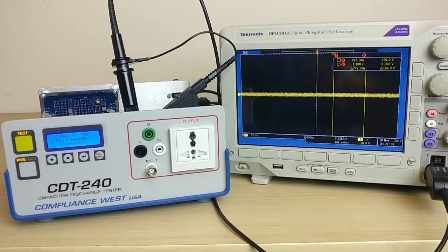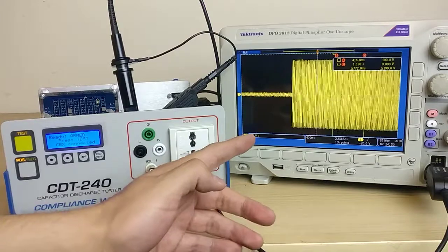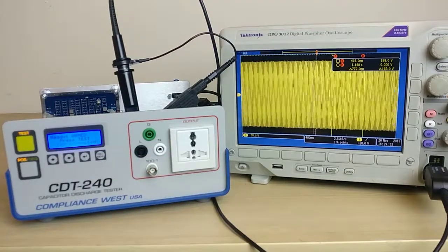Now performing the test can be a little bit tricky but with a little bit of practice and patience we can achieve it. First we're going to press the test button. As you can see we have the AC signal coming out of the CDT240.